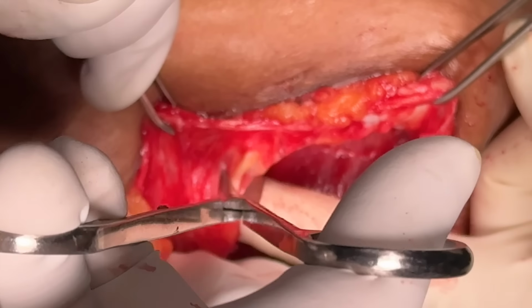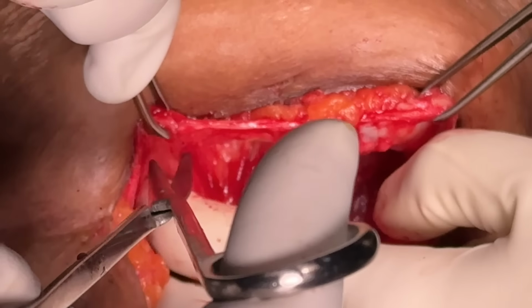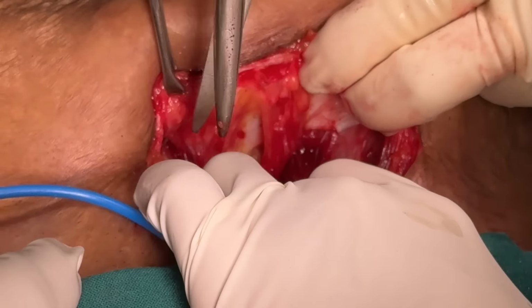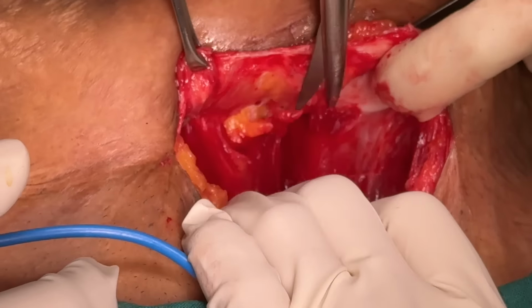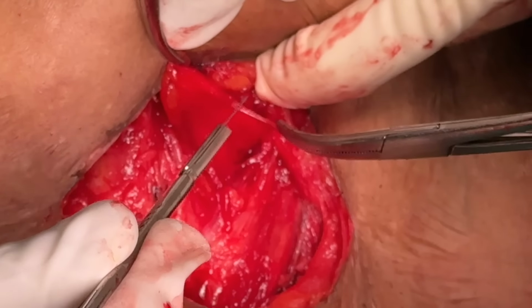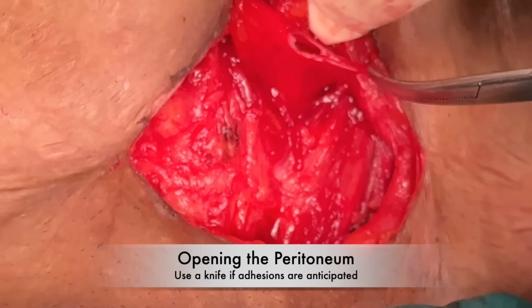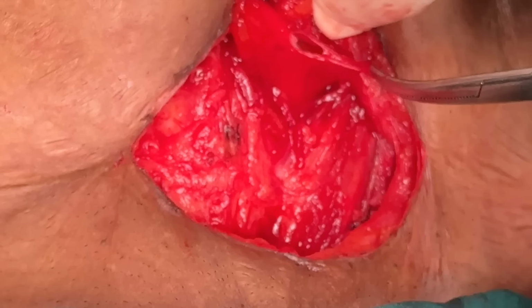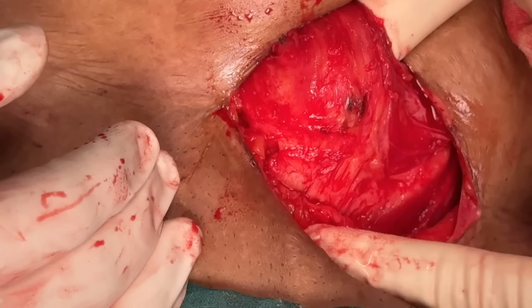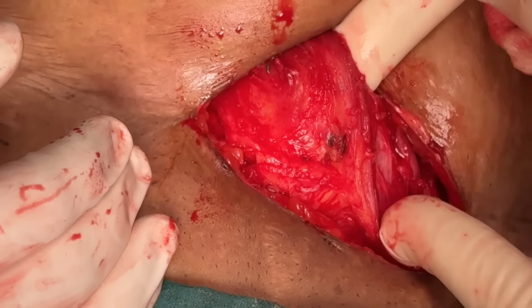As it is a case of previous cesareans and more adhesions, a sharp dissection is required. The technique we use here, carefully look at it, is called cut and slip. For the peritoneum, lift it up with the help of artery forceps and nick it with a blade. Once you are sure that nothing is adherent below it, extend it either with the help of fingers or with scissors. Here is the uterus.